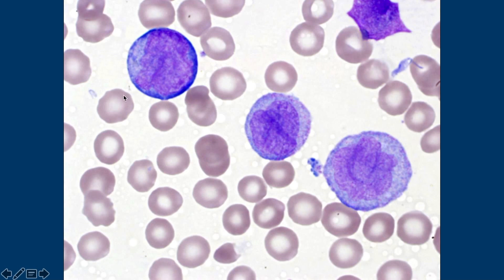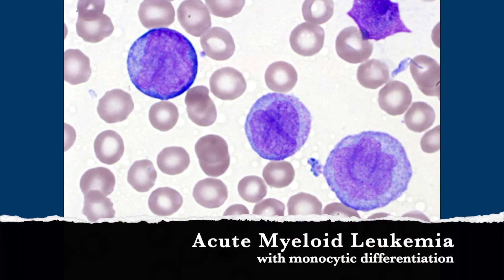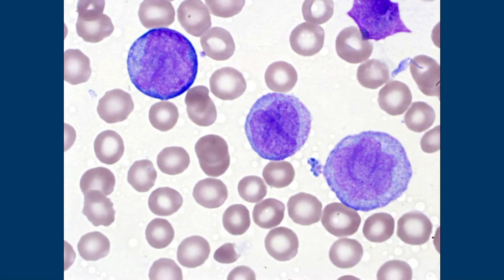Personally I would call that a blast. These are probably your promonocytes — they're considered to be blast equivalents. They're a little bit more differentiated, but blast equivalents in the context of myeloid leukemia with monocytic differentiation. It can be either myelomonocytic or acute monocytic. Either way it's a subcategory of acute myeloid leukemia.